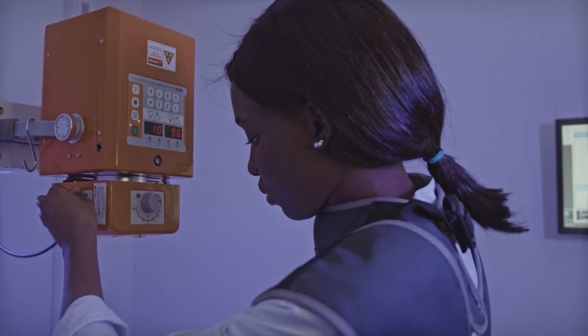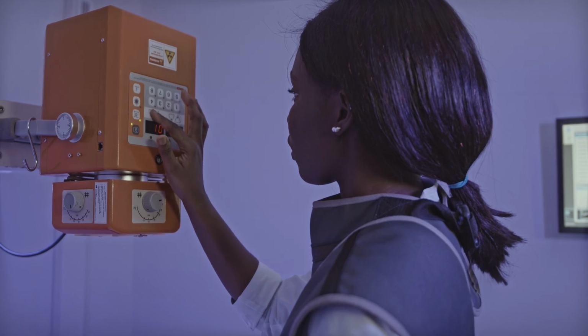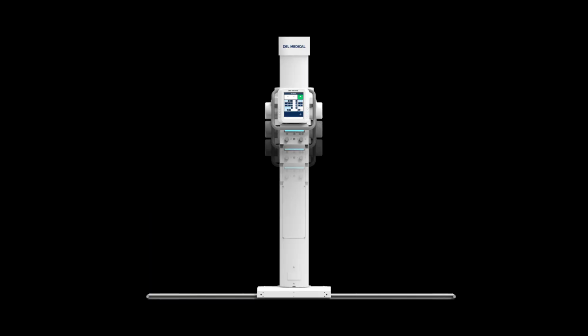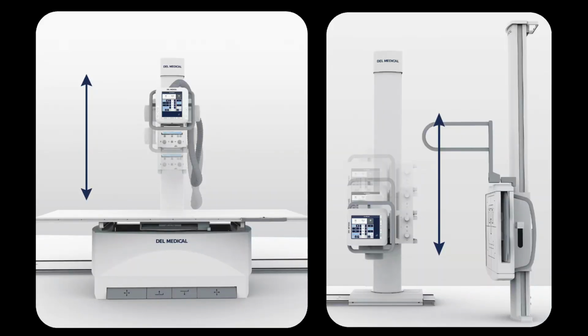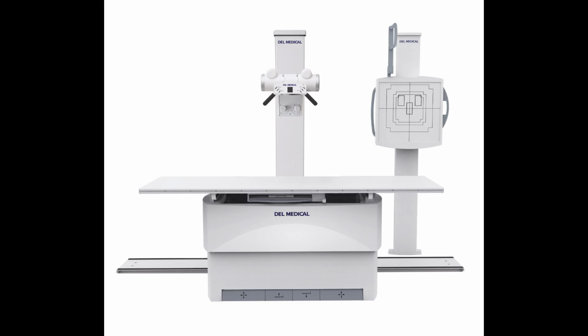So guys, if I want to explain it simply, a radiology machine is a combined system made of three main categories of components. One, mechanical components, such as motors, rails, arms, movement, and stopping mechanisms. These help the tube, table, detector, or wall stand to be positioned exactly where we need them for imaging.